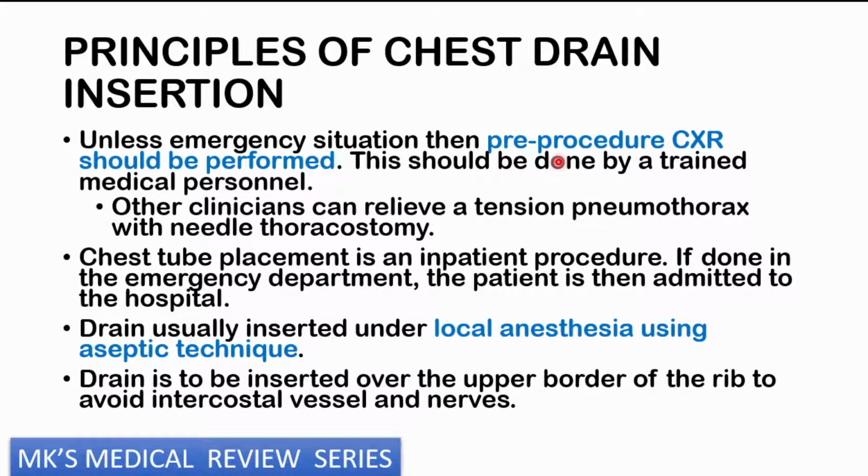So we'll look at the principles of chest drainage insertion. Remember that unless it's an emergency situation, you should always order a pre-procedure chest x-ray. Then you should ensure that the person that's going to be inserting the ICD has been trained to do this.